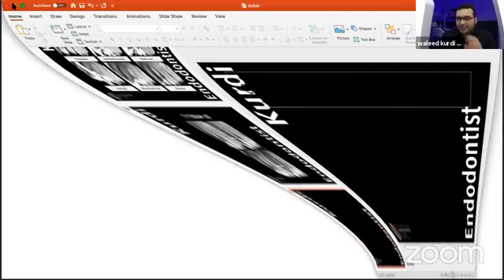I think the question is a little bit about when to stop, if I'm right. When to stop: simply according to the shaping protocol, or the shaping school you follow. Some people prefer 25/04, some people prefer 30/04. According to the shaping protocol you are following, just end on it. As I told you, I just reach 25/04, and after that you are free to stop at the shaping size and taper you want.